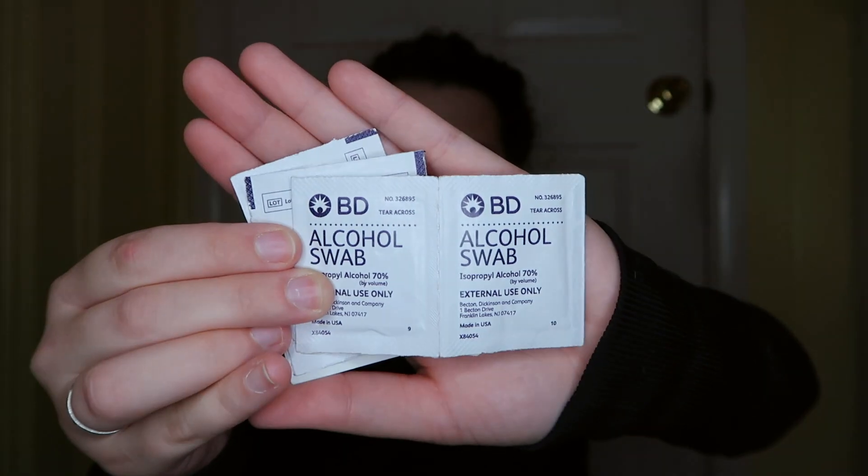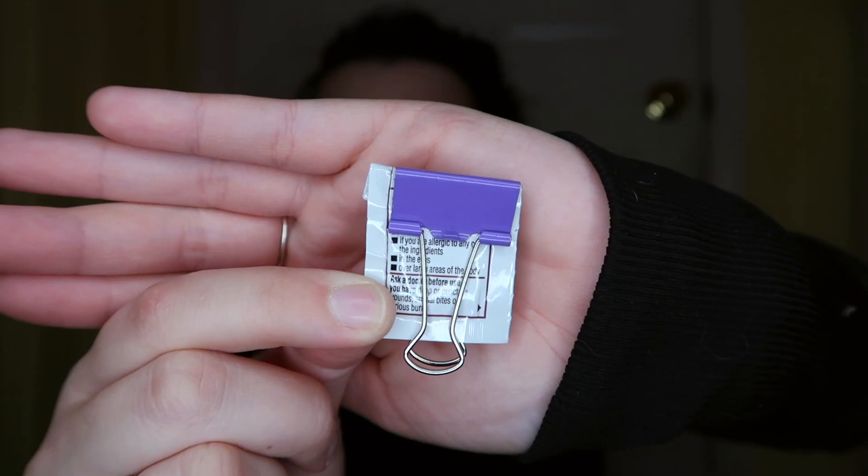In the first flat pocket, I have a bunch of alcohol wipes — you can never have too many. I have a couple of extra tubings because sometimes I have to change my pump site before I change my tubing and cartridge. I also have a travel pack of Neosporin with a binder clip on it, and four packs of fruit snacks — you can never be too prepared.